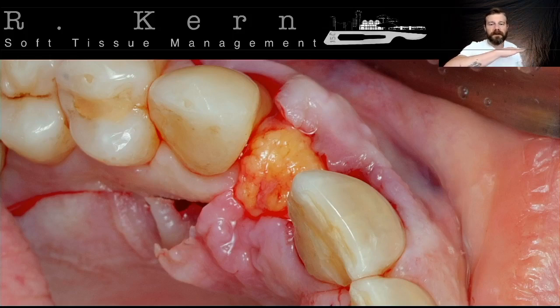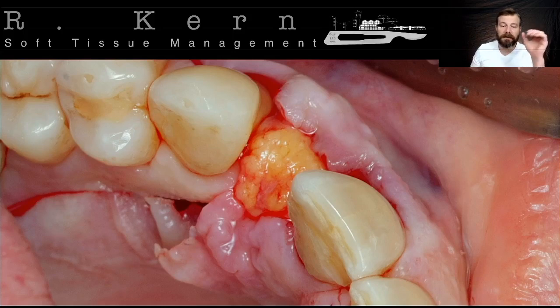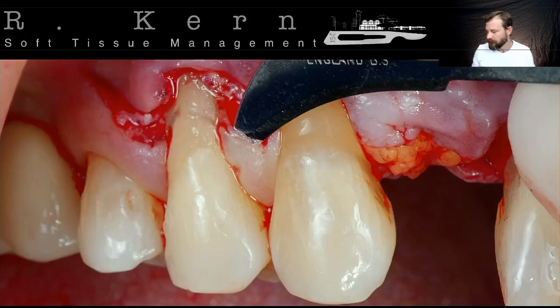Always try to keep the periosteum facing down. It means that you must turn the pediculum, not flip it over, okay? I'm going to try to maintain the periosteum against the ground, especially in cases where I'm doing some bone grafting together with this surgery. It is not this case here, but it's nice when using a pediculum to leave the periosteum against the biomaterial of the bone graft. Okay, this is regular stuff, okay?